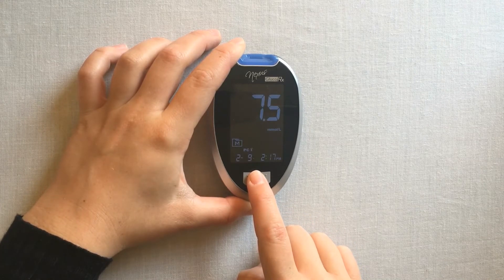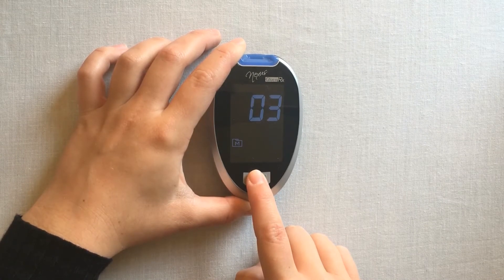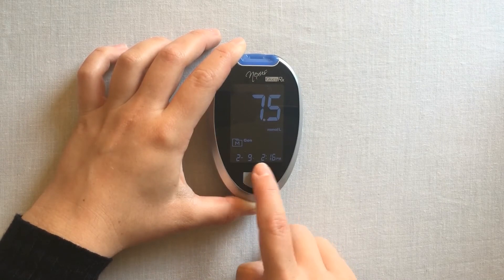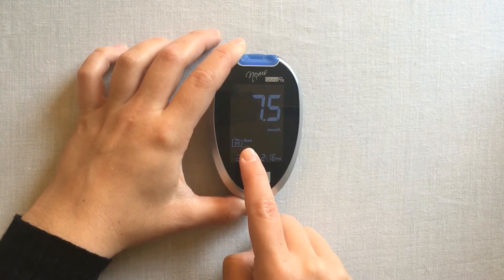Your latest result will appear on screen. You can continue to press the main function button to scroll through all of your recorded results. Notice that each result is labelled with the time and date at the bottom. Your meal marker will also be displayed.